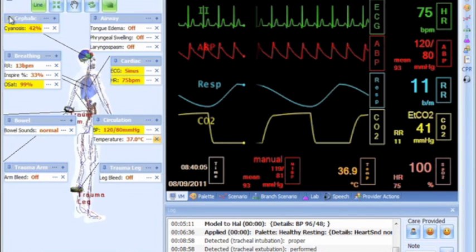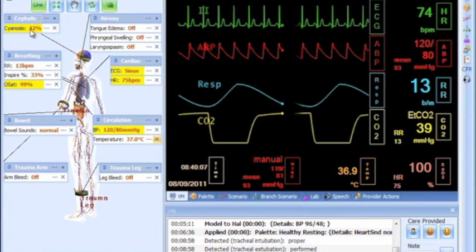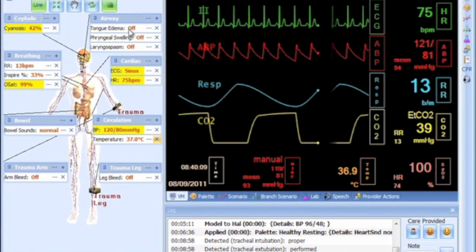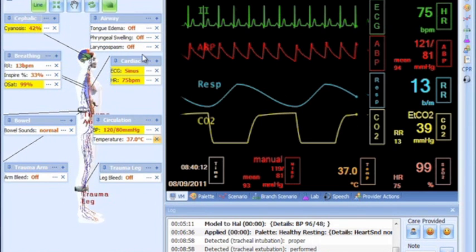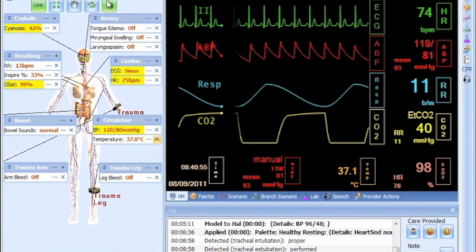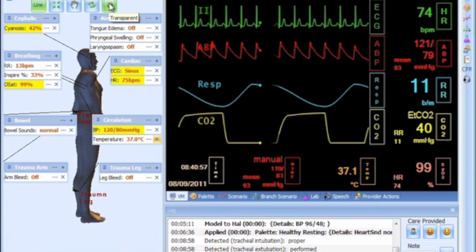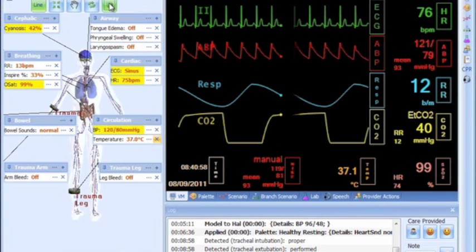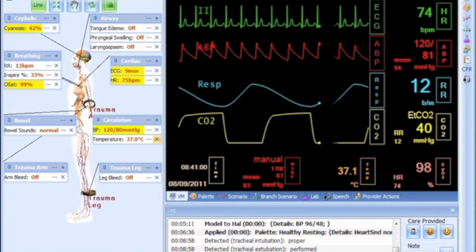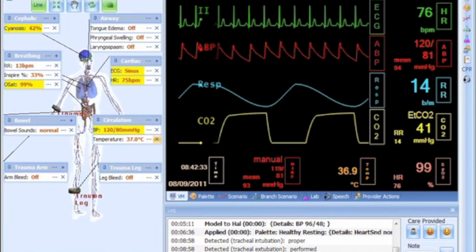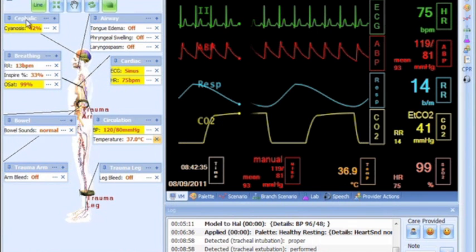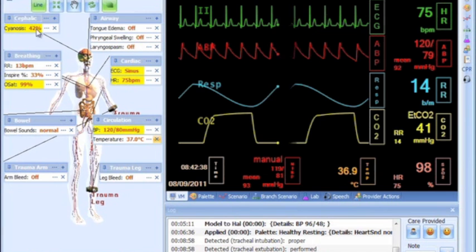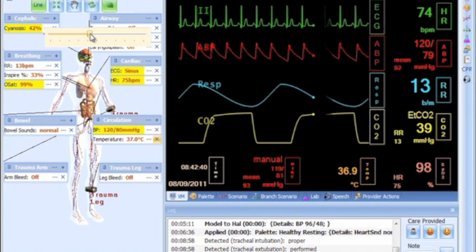The status details panel shows a 3D graphic interface of the simulator that contains the current vitals. The 3D simulator can be seen with opaque or transparent skin to give feedback to the instructor.